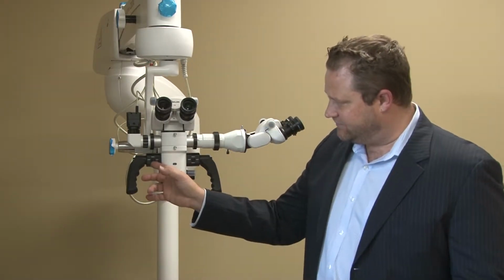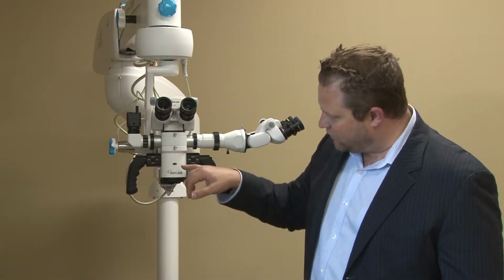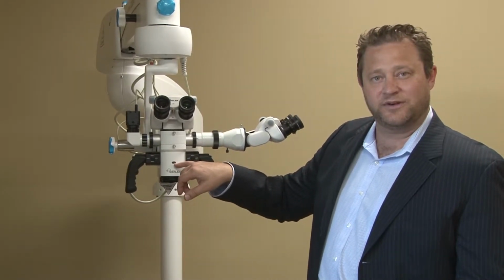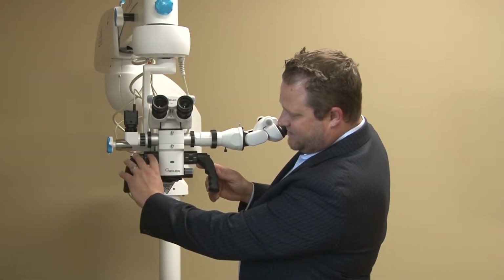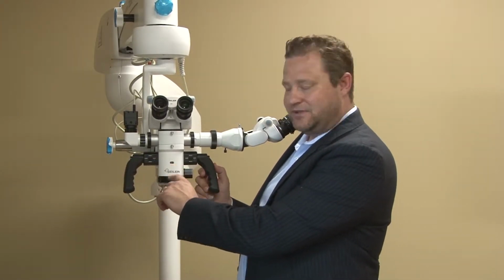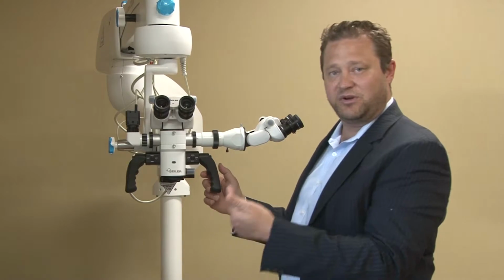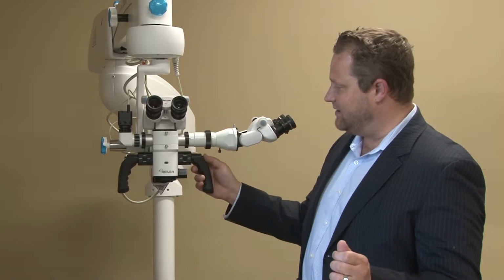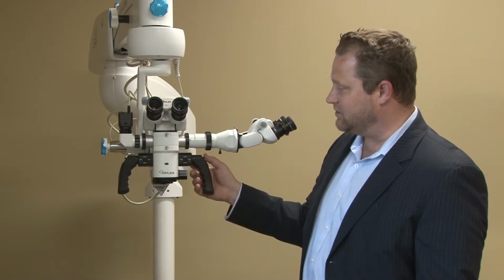With the zoom system, this is your motorized zoom, which is going to be on the left-hand side. And we have a little mag table, which is displayed in the indicator window. As you increase or decrease magnification, it will actually tell you what magnification you're at. You heard a beep. When you get to the maximum or the minimum, that's going to beep, and that's going to make the doctor aware that he can no longer move higher or lower depending on which position he's at.